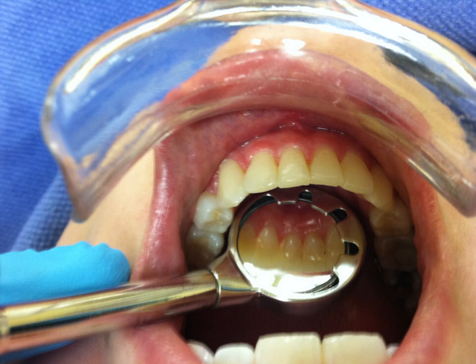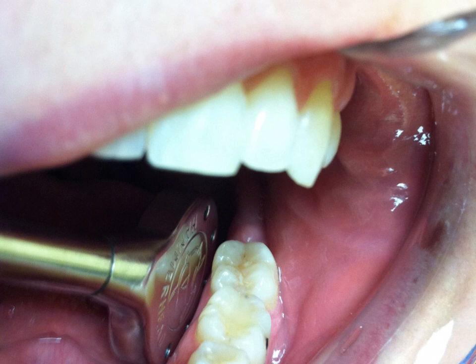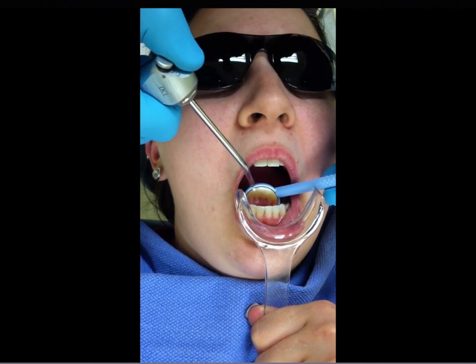This is where the New Bird really works well, because of the holes on the face — that's my favorite position to use this mirror in particular. Again, to scale all the lower linguals. Here's another blurry iPhone 4 picture showing the upper left and lower left molars. Now I'm going to go through a video showing all the same positions so you can see it live. She's using a cheek retractor just to get a better view.